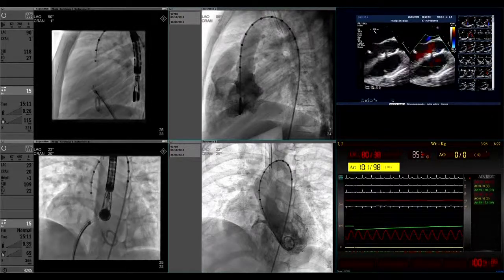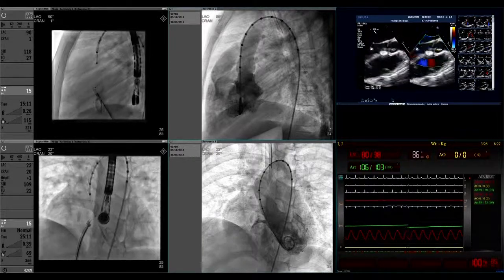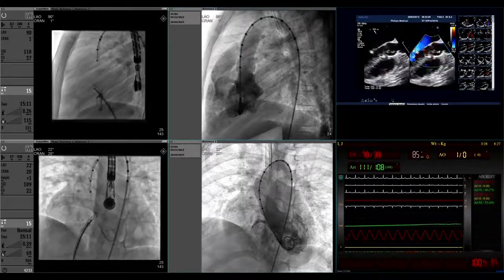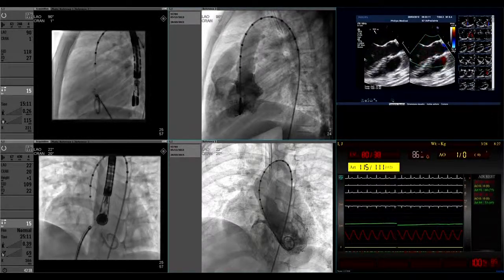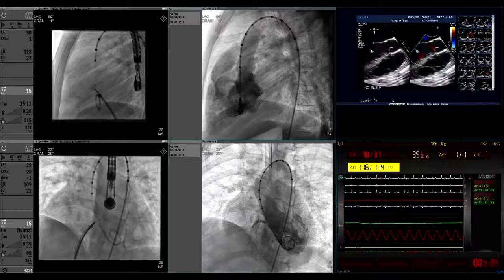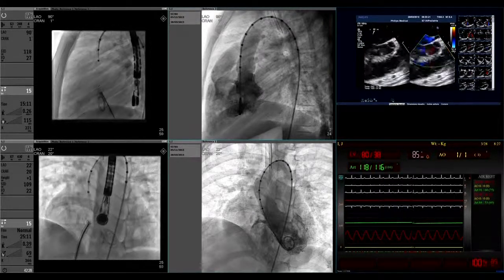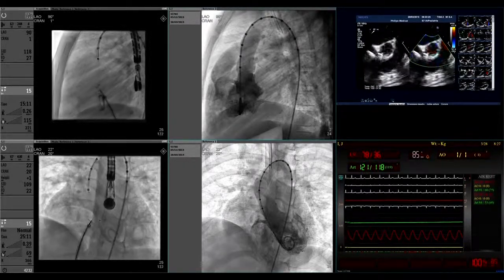So I don't use it again, but I don't know when the device is milking out. It looks very nice like this one, and after half a day, 1 day later, the device was anywhere, but not in the VSD. So my question is, how can you avoid... No. Chuck is coming back. Yeah. This is dangerous. So, yes, tell me what you can do again.